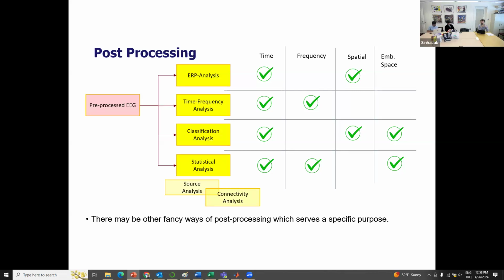But the idea is that based on the tasks or maybe conditions within the task defined prior to the experiment, you can actually do a little bit of averaging, for example, using ERP. Then you create your data vectors or data arrays, and therefore you run classification based on these data arrays to understand how separable these signals are.